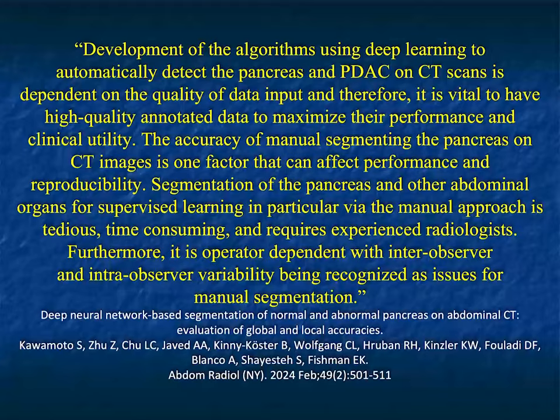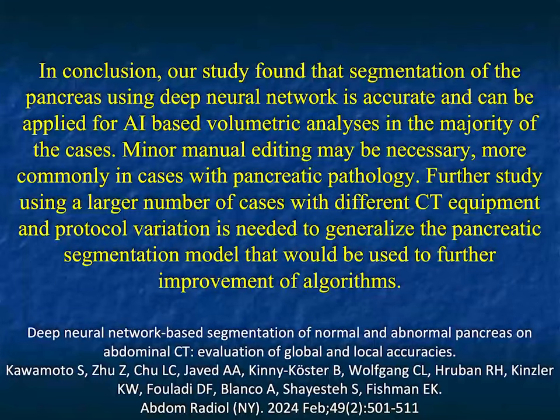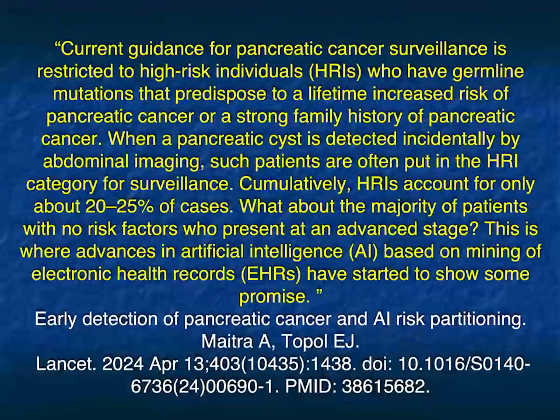In this article by Kawamoto, development of algorithms using deep learning to detect the pancreas and PDAC is dependent on the quality of data input, and therefore it's important to have high quality data. And we know that's always going to be the case. So you need to make certain you have good protocols. Kawamoto goes on to say, in conclusion, a study found that segmentation of the pancreas using deep neural networks is accurate and can be applied for AI-based volumetric analysis in the majority of cases, which is indeed very, very important.